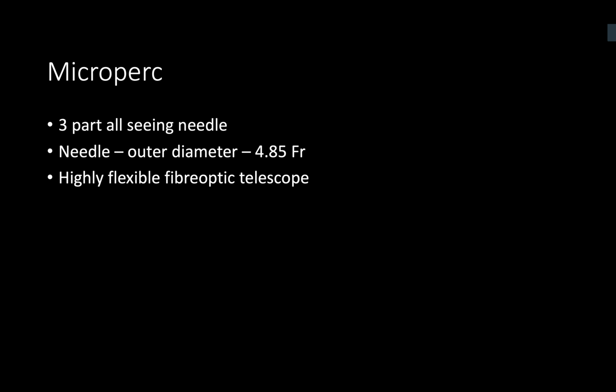So standard PCNL is around 26 to 30 French. Mini PCNL is less than 20. Ultra Mini PCNL is 11 to 13. And the Microperc is 4.85 French.